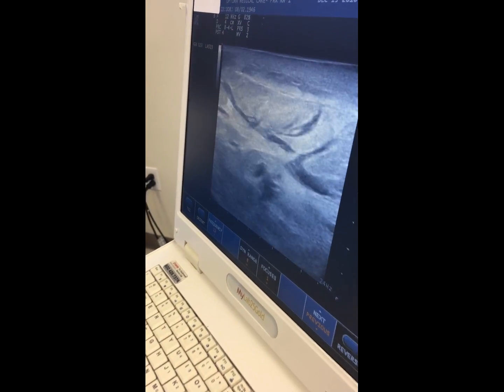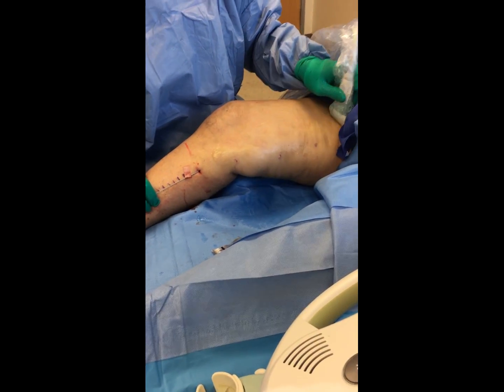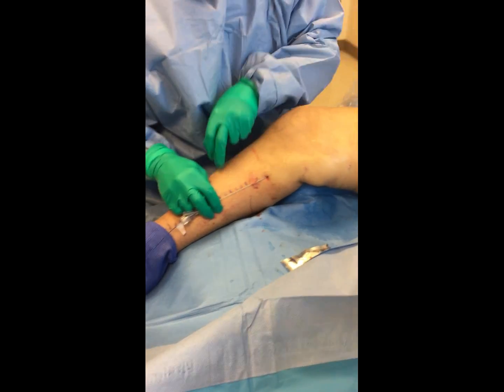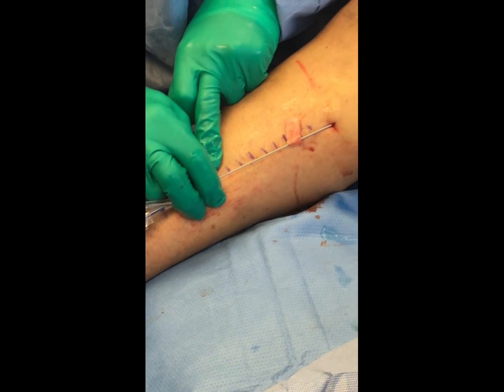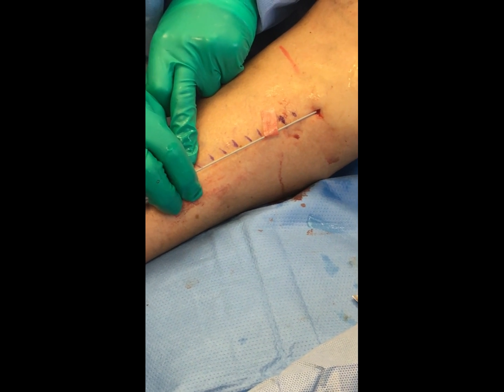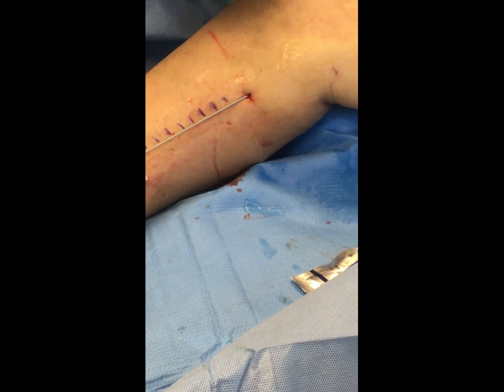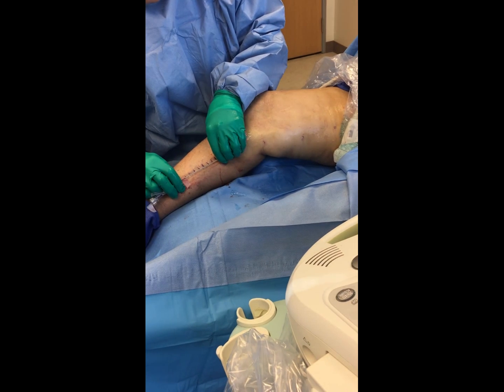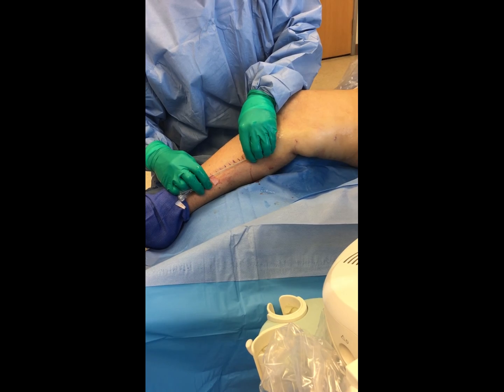I'll check the fiber to make sure there's no damage, and we're just going to bring this down. The reason I've put these little marks on her leg is that I'm applying a certain amount of thermal energy per centimeter in length — this way I have a little scale. I usually apply a little bit more energy at the very proximal segment of the vein because it's a little larger, and that's where we sometimes see recurrences.